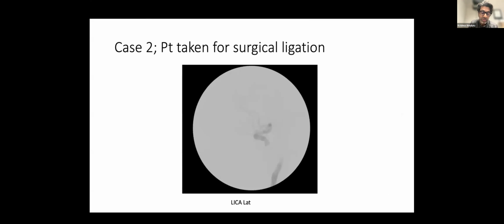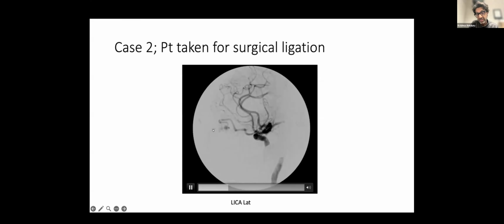surgeon. Once he retracted that left frontal lobe, he immediately saw this egress, the single draining vein. He was able to get down to the level of the anterior cranial fossa, put a single clip across it. Even with that, he was not entirely sure that he was able to occlude the vessel, so we did an intraoperative angiogram. And you can actually see here that there is still fistula present, but that venous outflow was occluded.